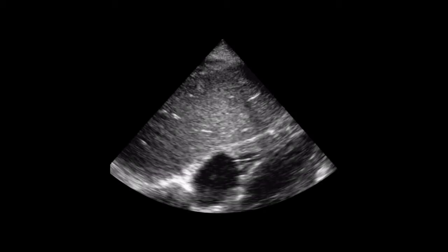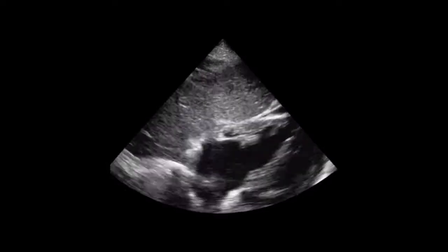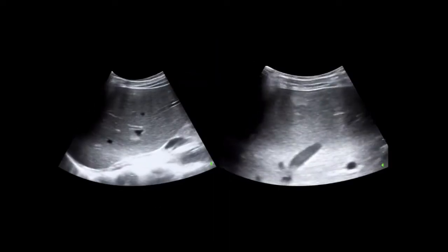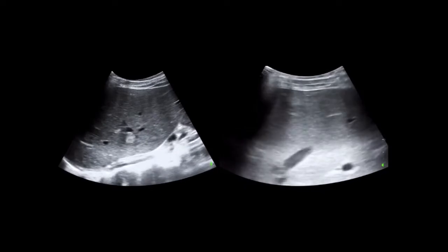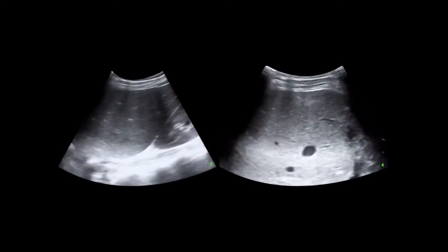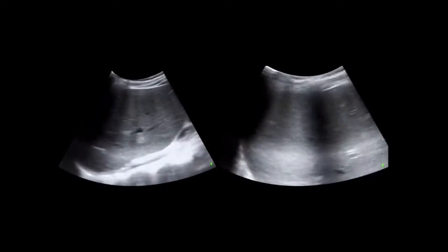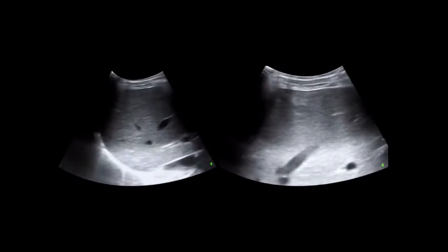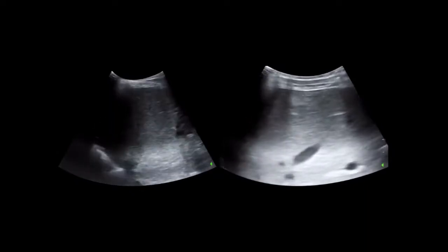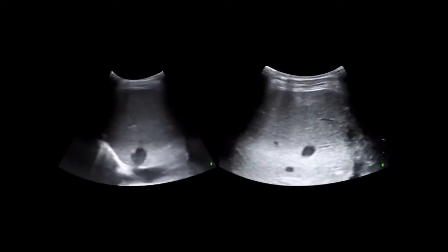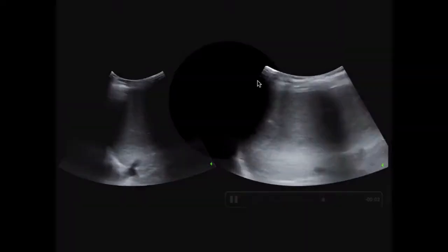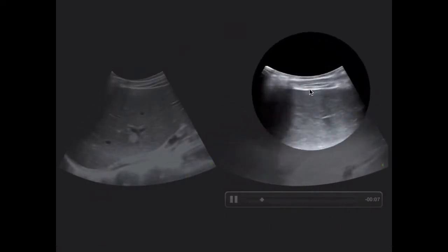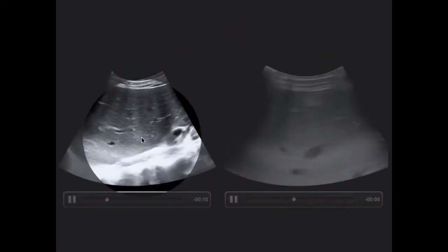That patient I just showed had this big booger on the tricuspid valve. I've actually found septic emboli in the liver and the spleen as well. Can you see the little white spots inside the liver in these images? These were septic emboli to the liver found on ultrasound — one up here, this big one right here, another one right there.